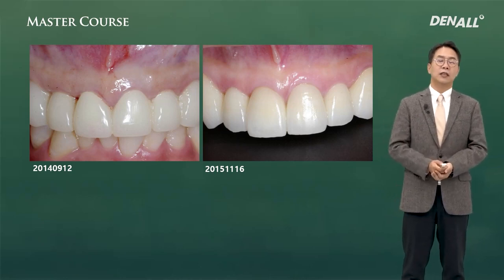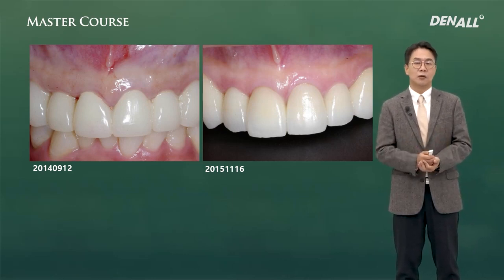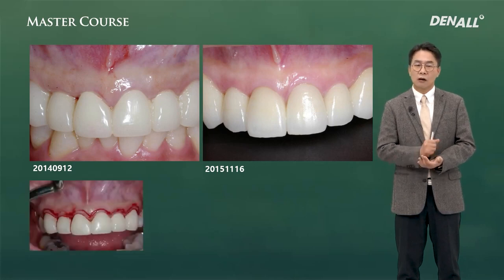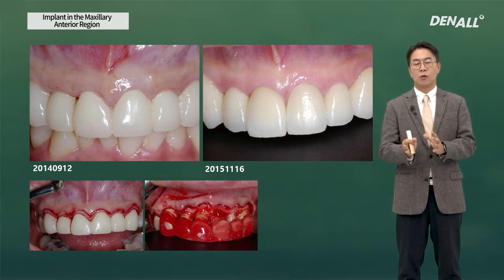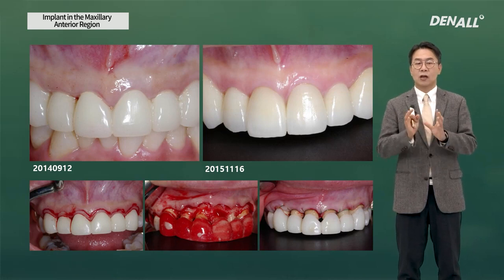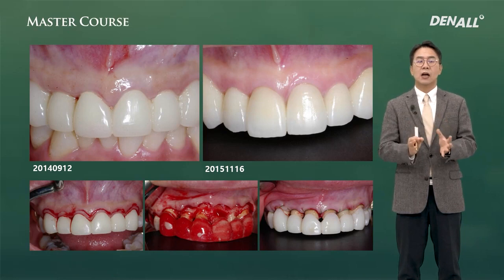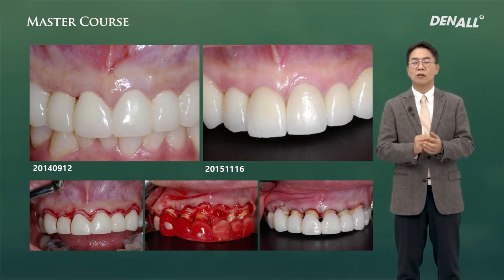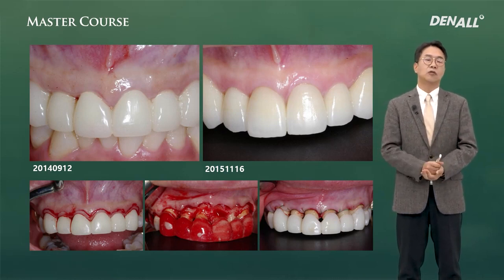How can we implement that? From the maxillary anterior perspective, this is not necessarily related to implant. Here, crown lengthening is done, and the gingiva is cut off as desired. Bone contour is controlled. If you look closely, something is on the teeth. That means something will be made if the size of teeth comes like this. So using the template, we are controlling the soft tissue as well as the hard tissue.